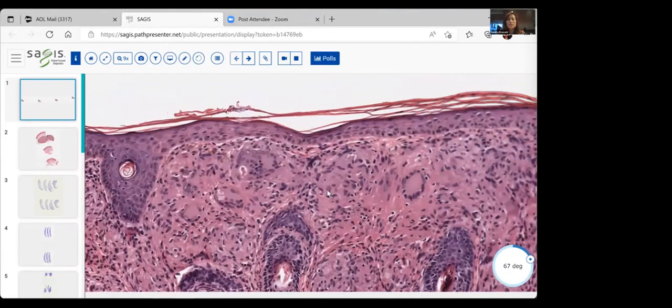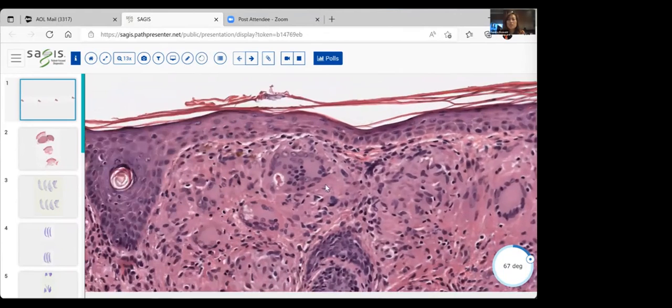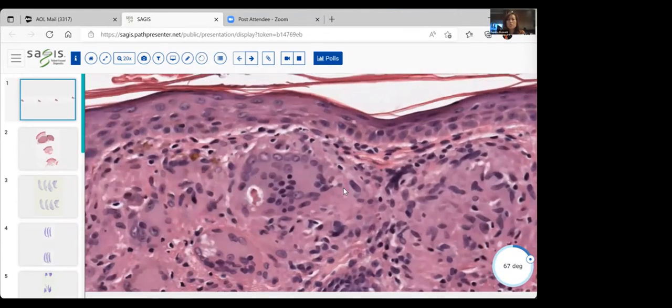And then if you look over here, you see another great example of a multinucleated histiocyte, another large cell. But in this case, the nuclei are not just arranged around the edges of the multinucleated giant cell, but scattered all across, like the residents say, a chocolate chip cookie. And this is a foreign body giant cell.